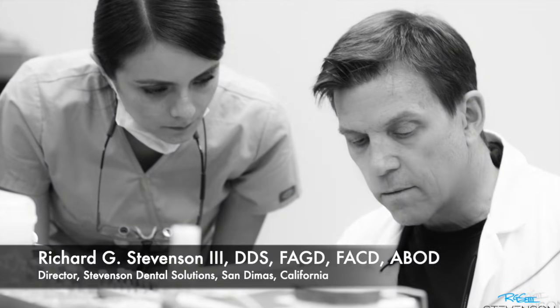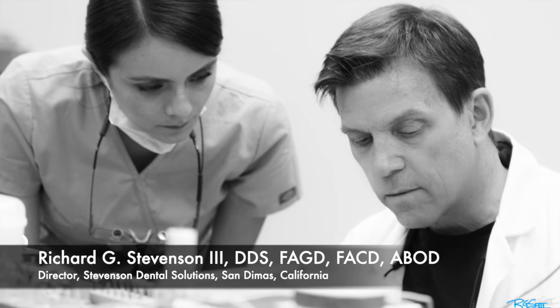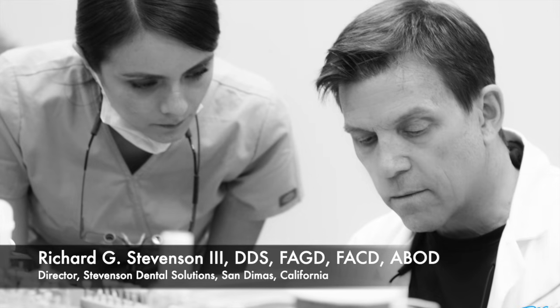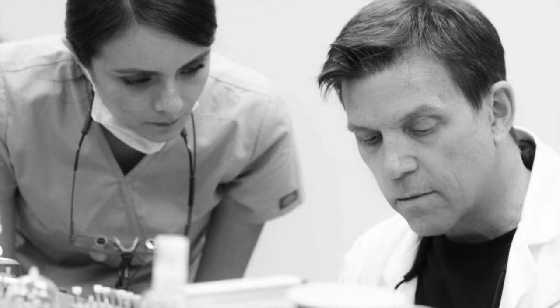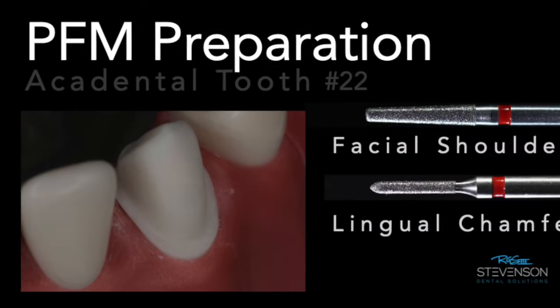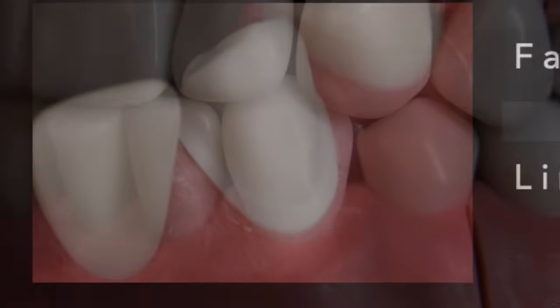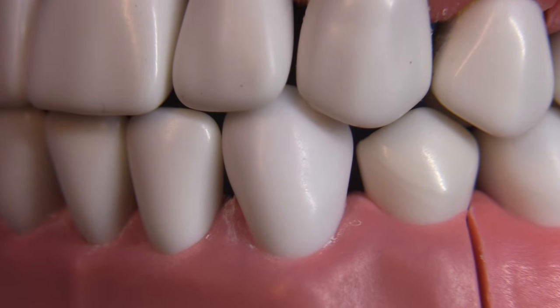Hey everybody, I'm Dr. Richard Stevenson and I'm the director of Stevenson Dental Solutions in San Dimas, California. We're a teaching center dedicated to excellence in overall knowledge enhancement and skills improvement. Today we're going to tackle the PFM preparation on the mandibular canine — a pretty tricky preparation unless you follow this really simple technique that I'm going to show you.